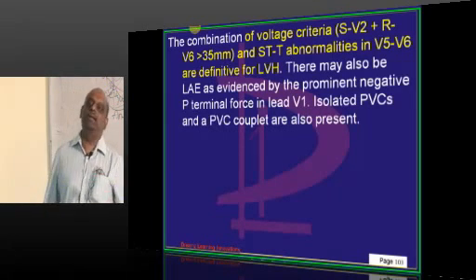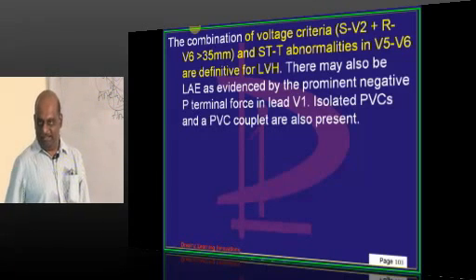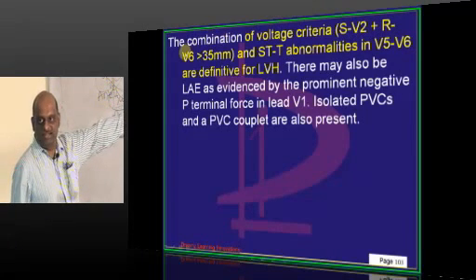So what are the criteria to call it? Lyon-Sokolow criteria? Look at the lead V2 and look at its S wave. Look at the R wave in the lead V6.